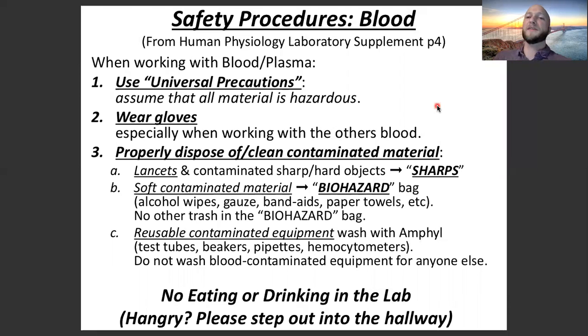Whenever you're handling somebody else's blood, use universal precautions. That means you assume all material is hazardous, so you treat it as such. You wear gloves, especially when working with the blood of others. Properly dispose of and clean contaminated materials.